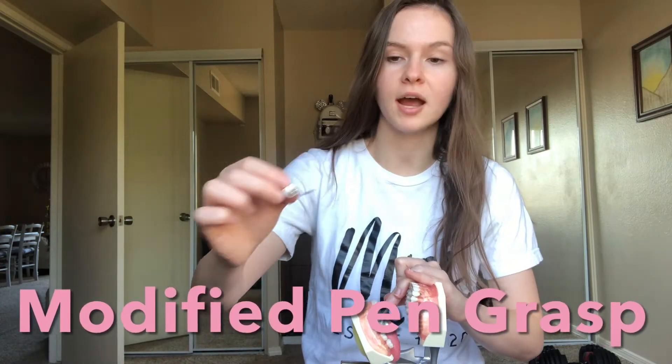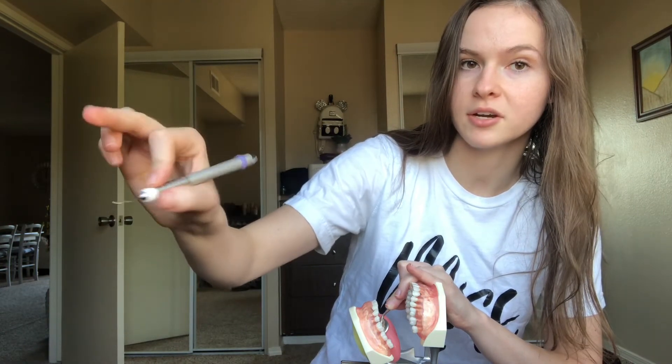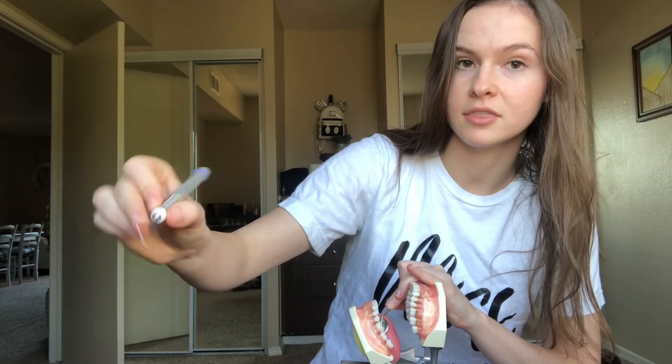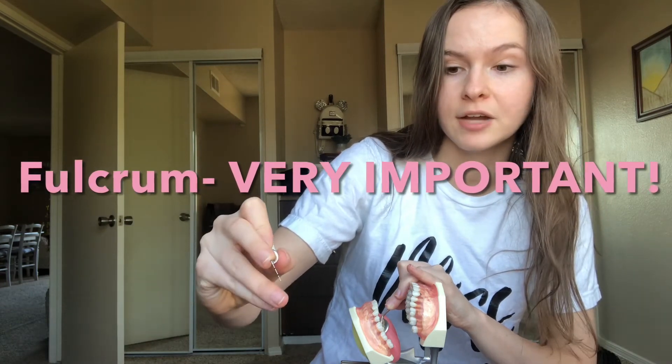This is the modified pen grasp. You have your thumb and your pointer finger making a C-shape, and they're in line with each other. Then your middle finger is resting on the shank of the instrument, your ring finger is the fulcrum — that's your stability while you are moving around the instrument — and your pinky stays right next to your fulcrum.